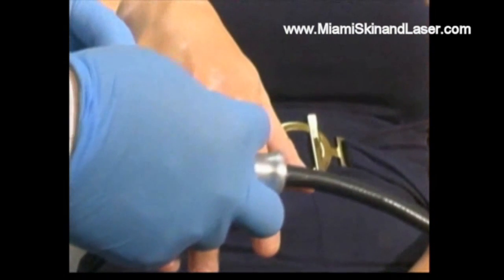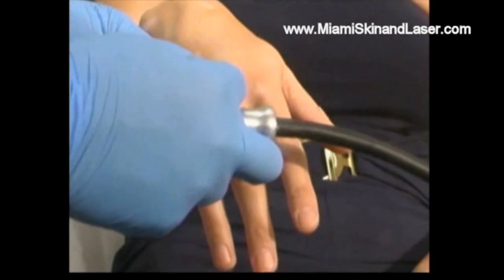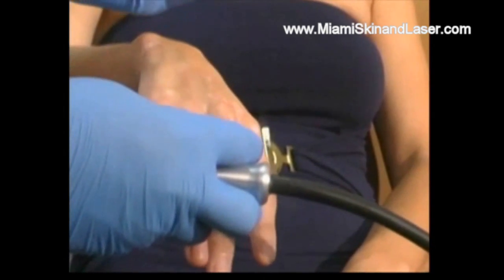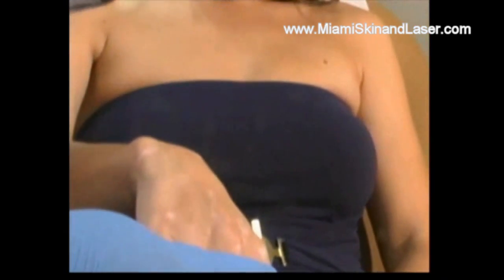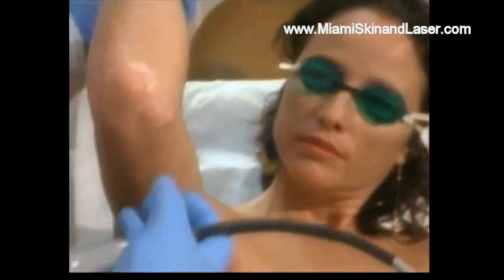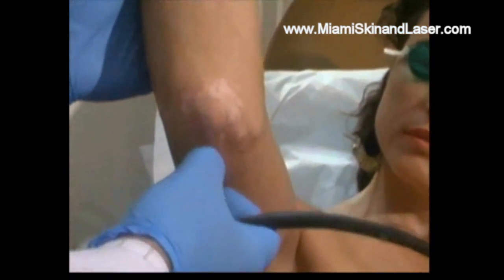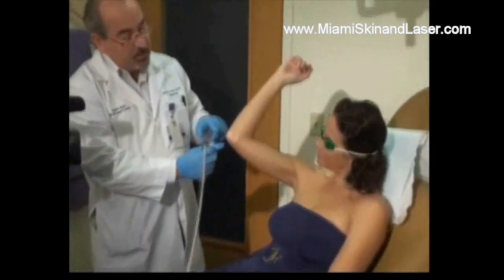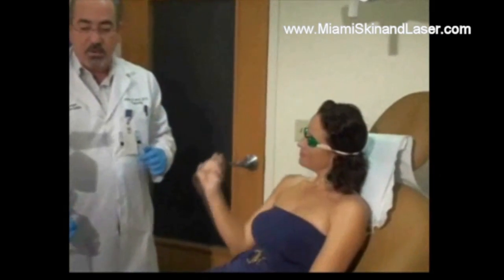As we can see here in the areas of white, there are little islands of pigment — little brown areas. That is the cells that produce the pigment coming up through the hair follicles and repigmenting the area. You can see a nice example on the elbows: before treatment this was completely white, and now little dots of pigment are starting to emerge and will eventually repigment the entire area, making our patient very happy.